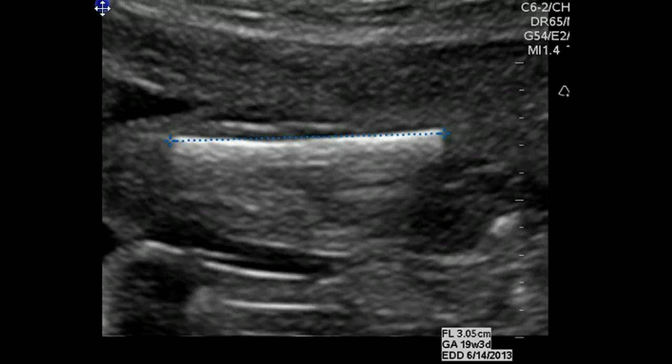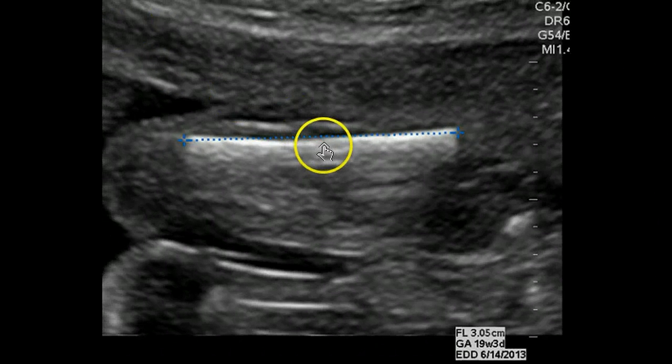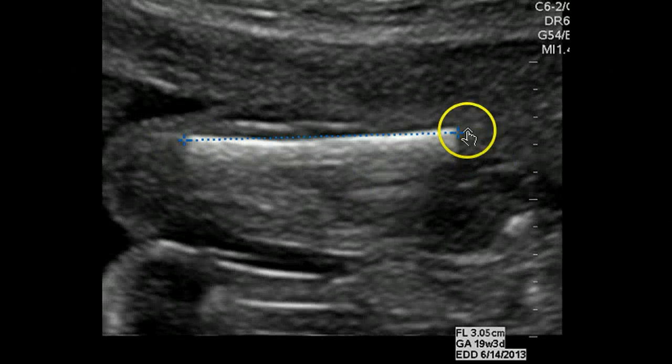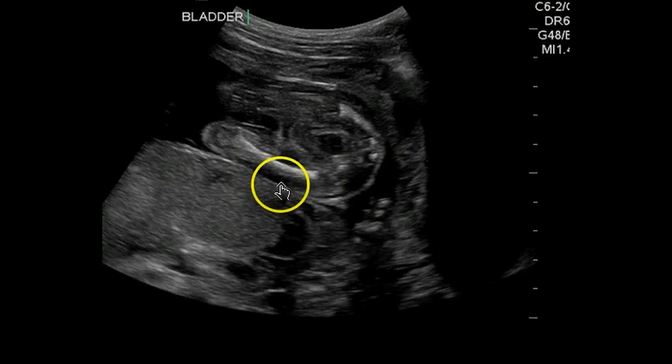I don't know if I can make this a little bigger or come over a little bit so we can see the whole picture. Up here, that's the femoral head. This is the trochanteric region with cartilage, all cartilaginous. So we like this measurement. Same thing here, we like the measurement.